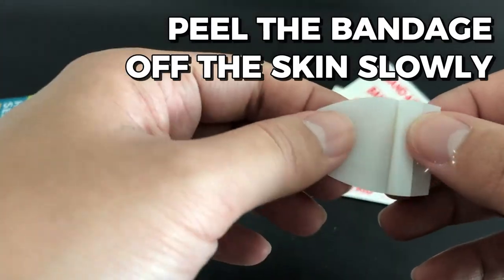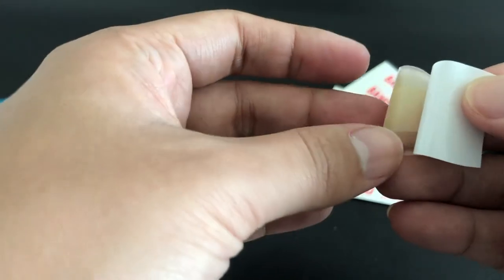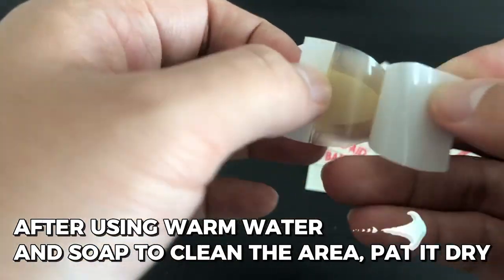Peel the bandage off the skin slowly when it's time to remove it. After using warm water and soap to clean the area, pat it dry.